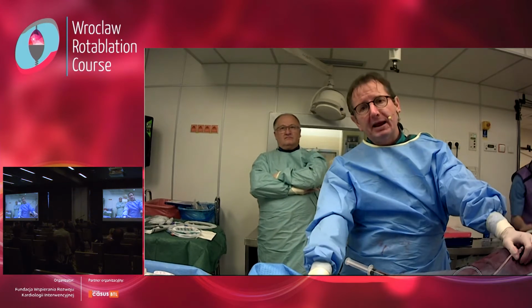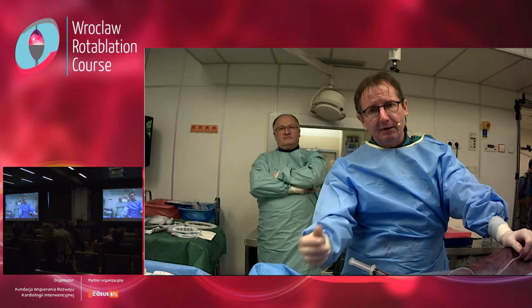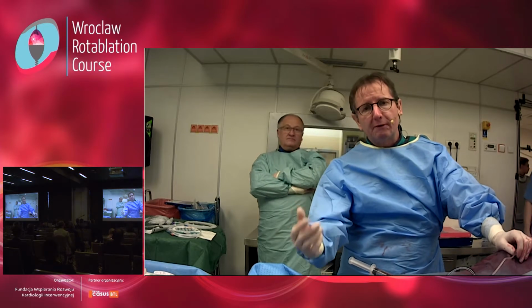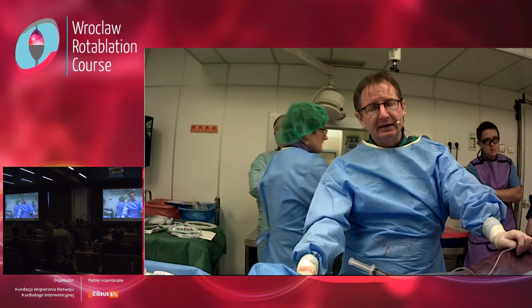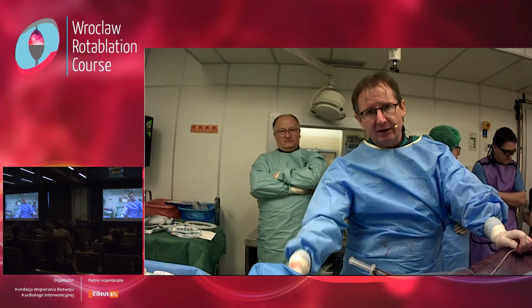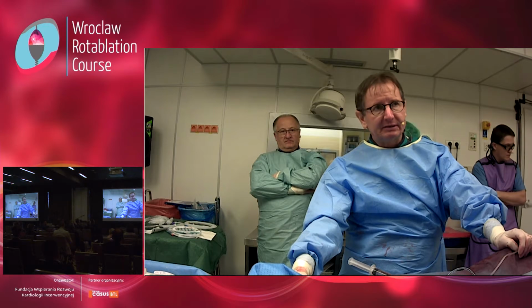And the main problem was that multiple predilatation with big balloon provoked, I think, prolonged ischemia, and over this mechanism he went to the unstable rhythm, and then of course pressure was down, and that's why we had some stress now.